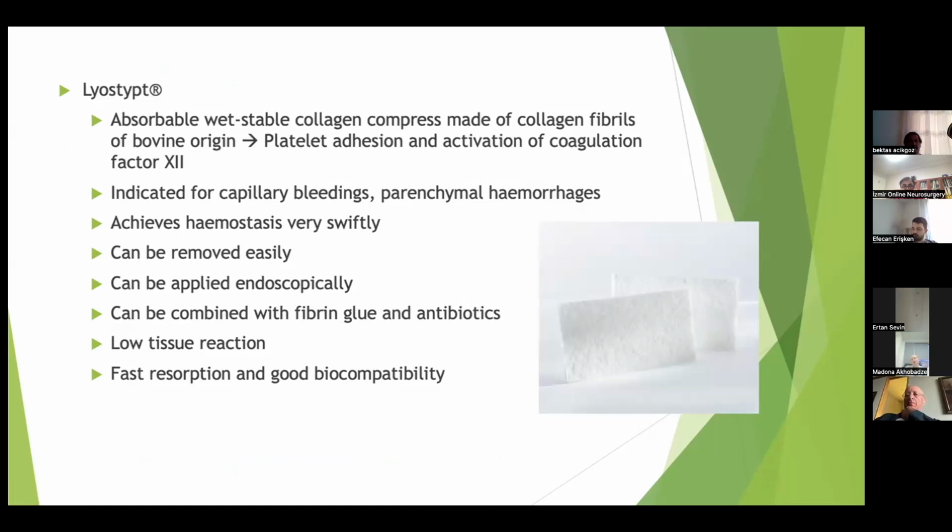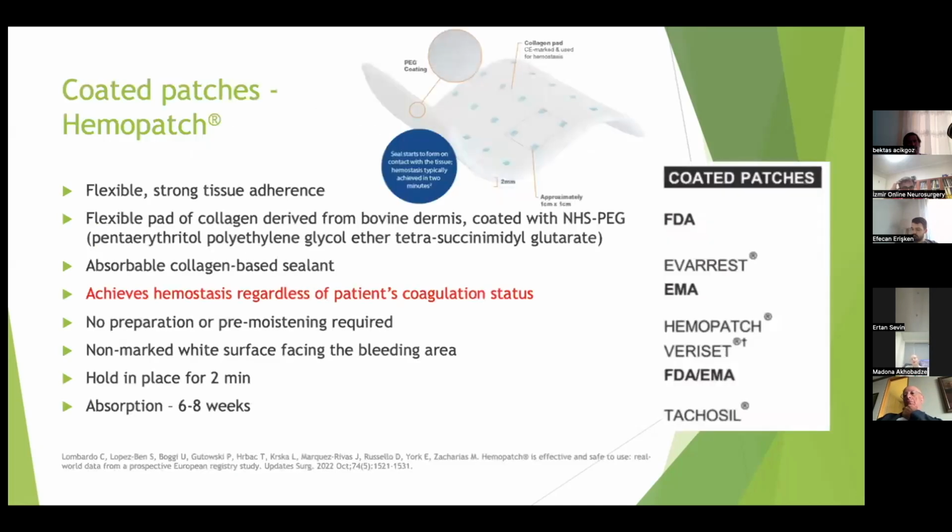It can be removed easily. It can be applied endoscopically and can be combined with fibrin glue and antibiotics. And it has low tissue reaction, fast absorption and good biocompatibility. It is quite widely used in endoscopic surgeries.